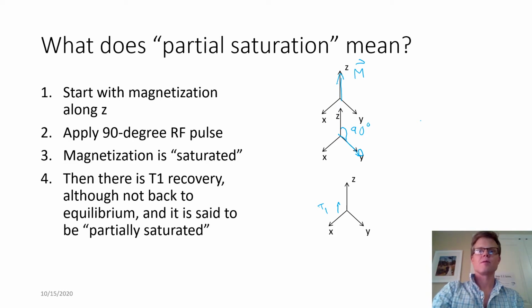And maybe if we pick a later time here, where T2 decay has occurred, we're left with net magnetization recovered, but not back to equilibrium.